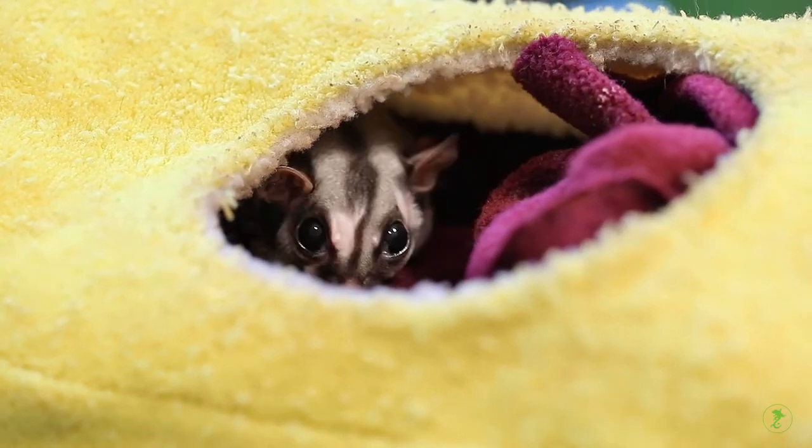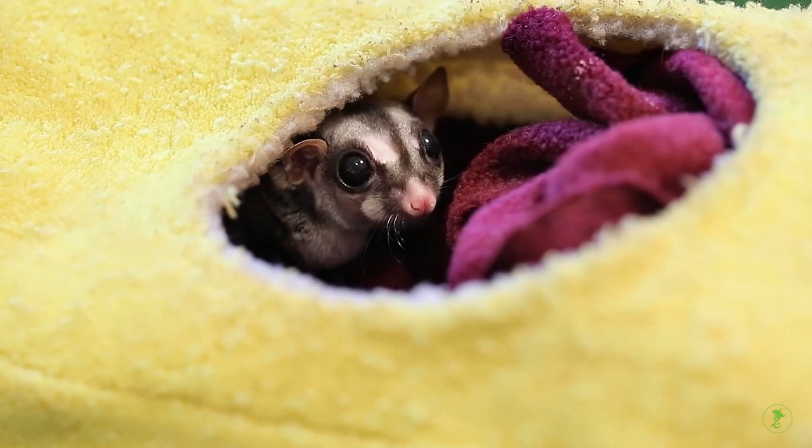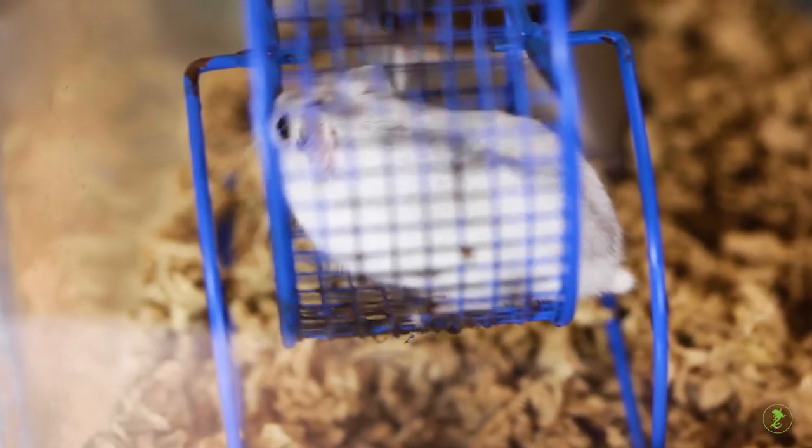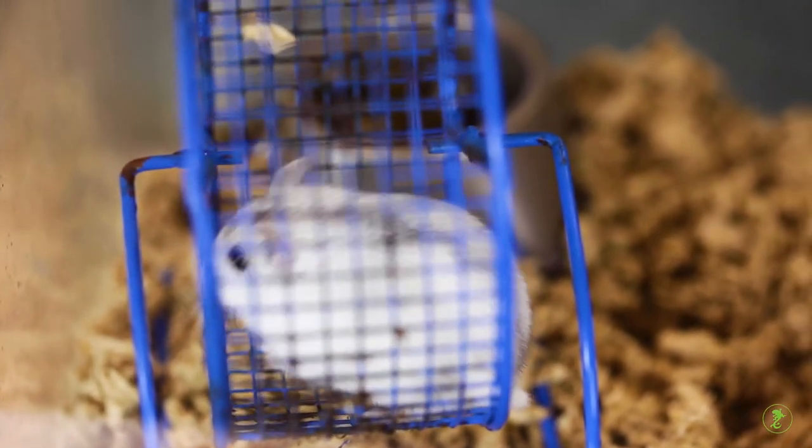Do not attempt to take the temperature of sugar gliders due to their unique anatomy, very small pets, or any pet that struggles excessively.